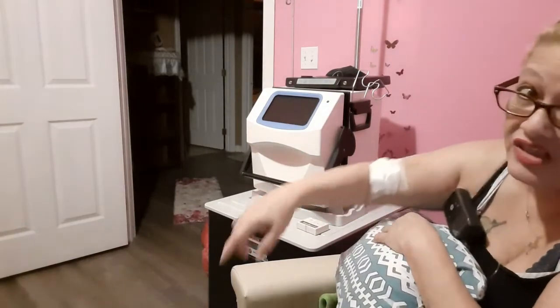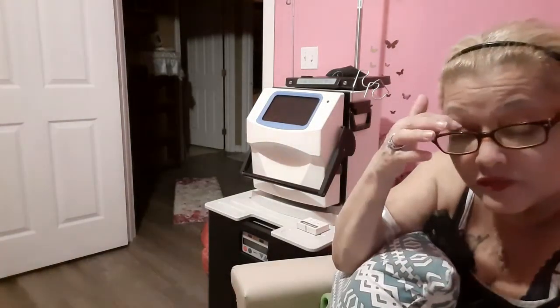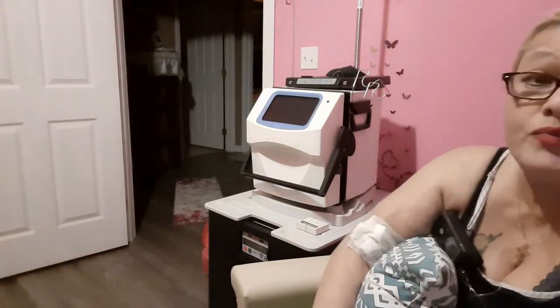And we have to check that sensor. It's very vital that it works. Because if there's any fluid, any leaks whatsoever, you want to know so you can stop treatment, do an emergency rinse back, get your blood back and get off of there and then dialyze another day. So it's very important not to forget to check that every day.